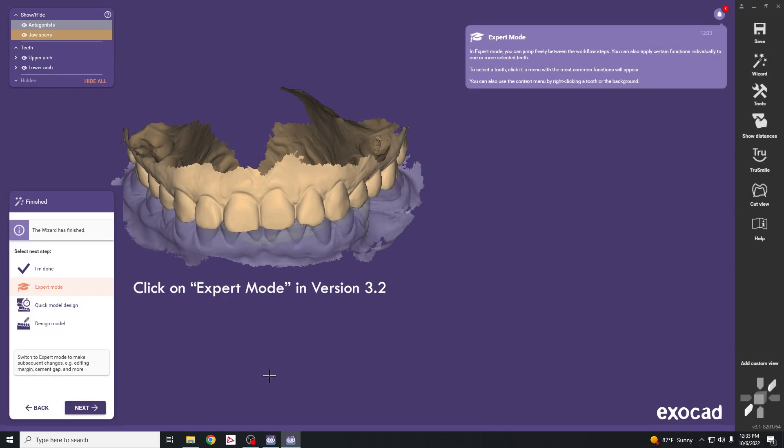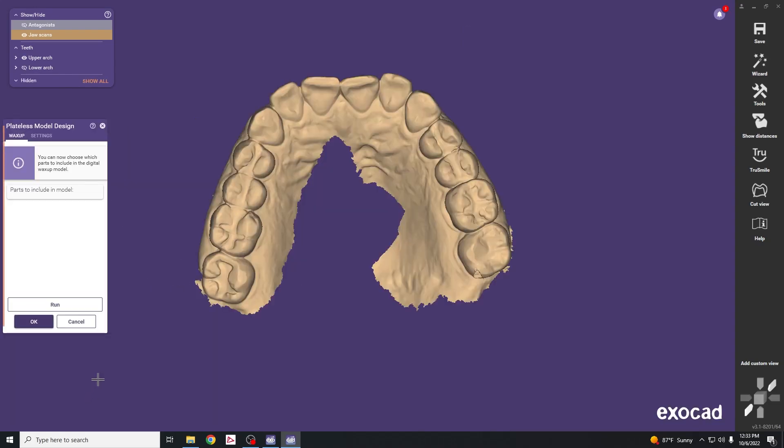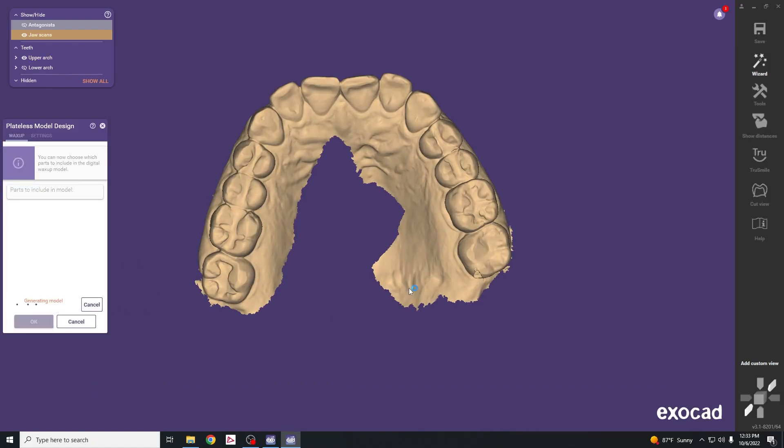Highlight the lower bar and click on plateless model design. The upper jaw is selected, so hit run and this will add a platform to the scanned model.